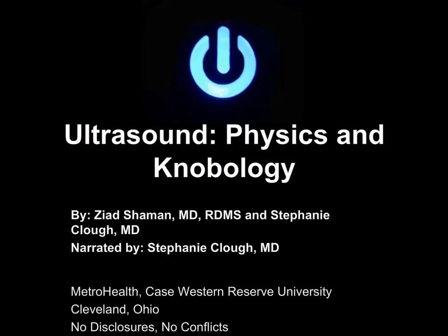Welcome to Ultrasound Physics and Knobology. The purpose of this online module is to provide the foundation necessary to obtain high-quality images.